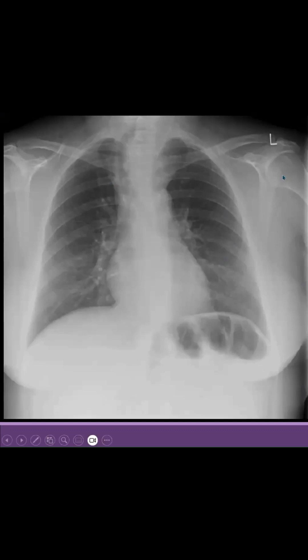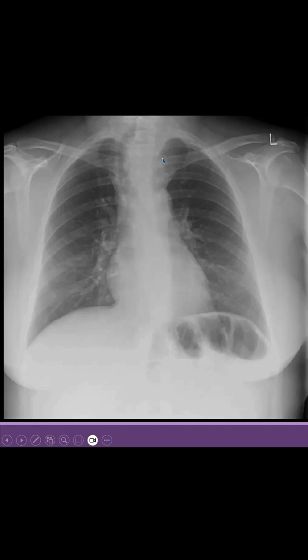If you have a look at this X-ray, here you can see that the most common finding, the most common abnormality of mediastinum which you will see on X-ray is widening of the mediastinum. The space here will appear more than normal. Like in this X-ray, you can see that this space is appearing more than normal.